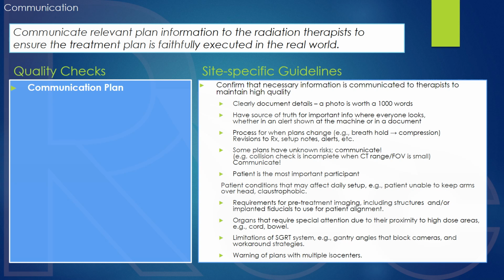Clearly document the details. A photo is worth 1,000 words. Take pictures at CT Sim. Have an established source of truth for the important information so everybody knows where to look, whether this is an alert that's shown in the machine or in a document or in a prescription.